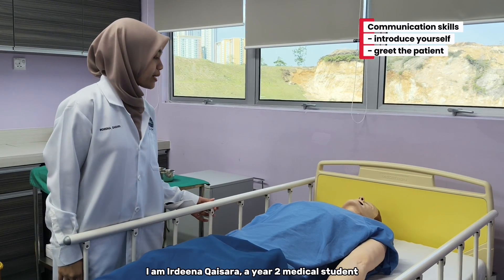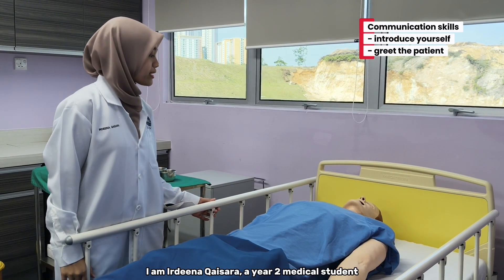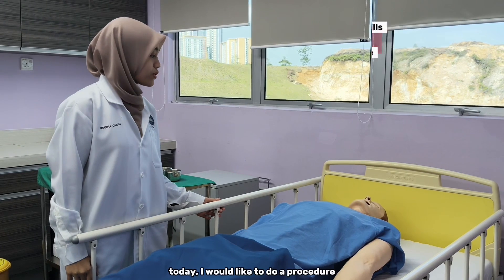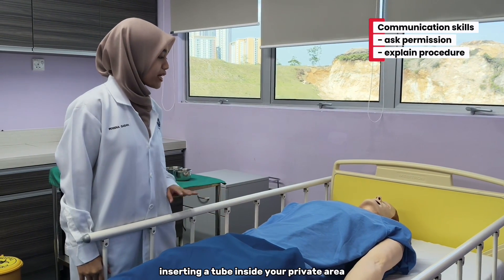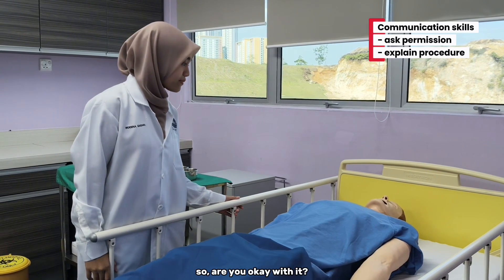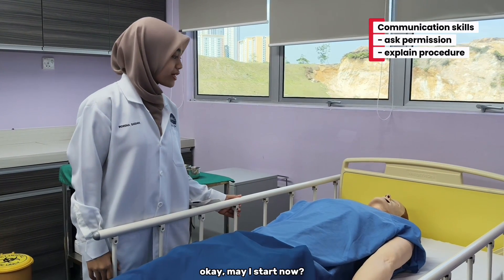Hi, Assalamualaikum. I am Bidina Kaisara, a U2 Medical Student from UC. Today I would like to do a procedure that involves inserting a tube inside your private area. Are you okay with it? May I start now?